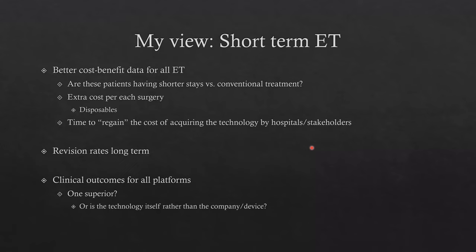Yeah, I can tell you, and this is not published, but in our hospital, the way that we did it is basically for the first 6 months, we just had the same team all the time. It was unbelievable. Kudos to Dr. Chua. I don't know how he did it, but he did it. So basically we had three reps from the company, just one for the robotic arm and two just opening trays, from the get-go.